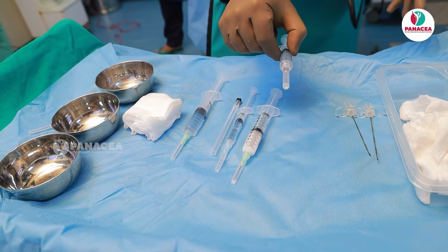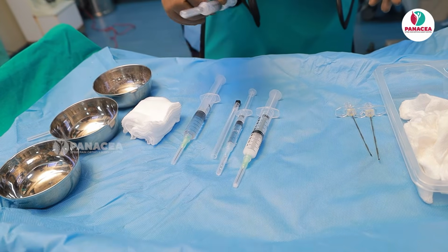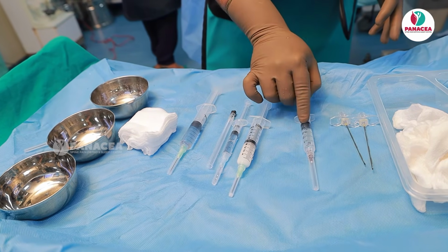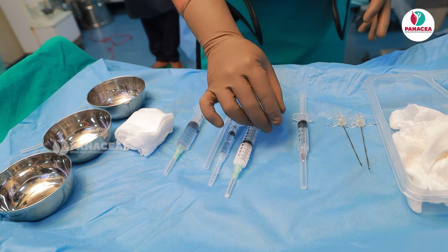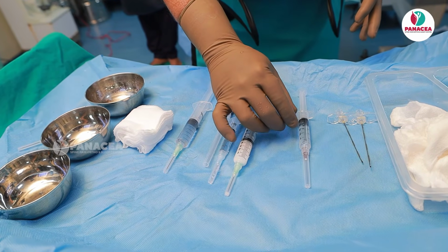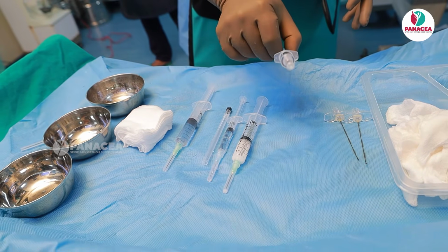So I am keeping this away, and this is 1% lidocaine, which is preservative free. Normally the 2% xylocaine or lidocaine available in the market has a preservative, but this is preservative free. This is nothing but xylocard, which most cardiologists use. It is available in 2%, but I made it into 1%. I took almost 2.5 cc of 2% xylocard and diluted it with saline. I made it 5 cc. This is for local infiltration.